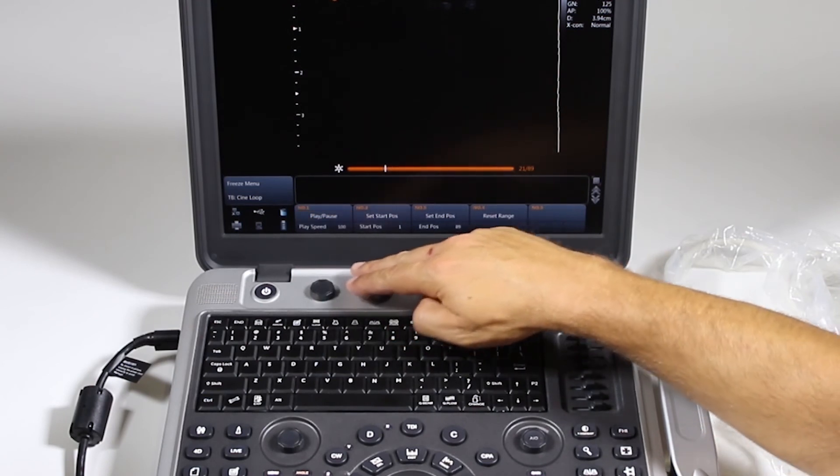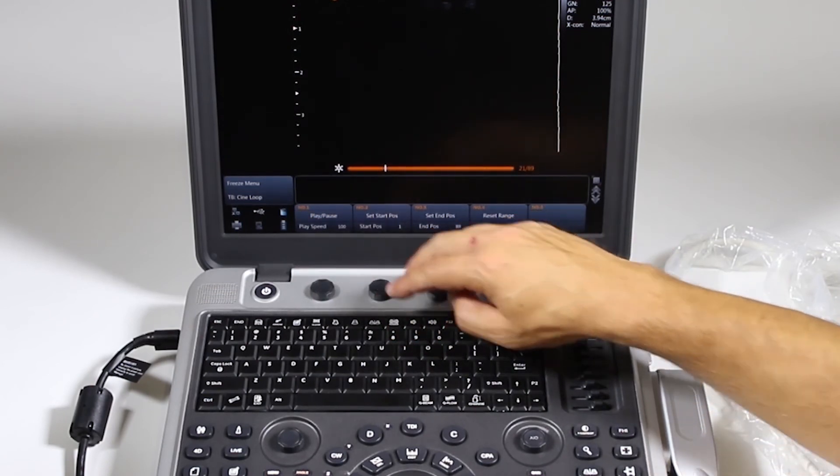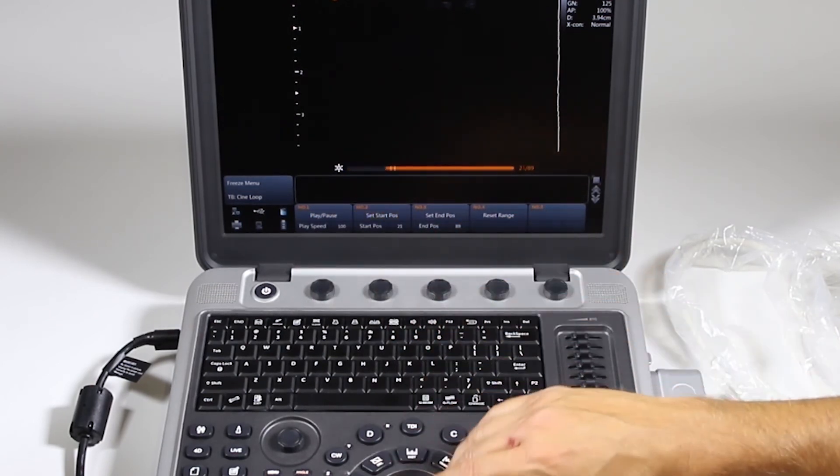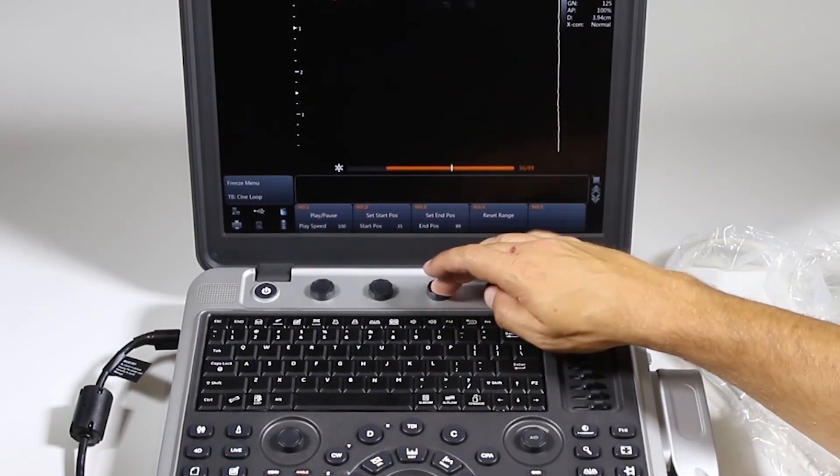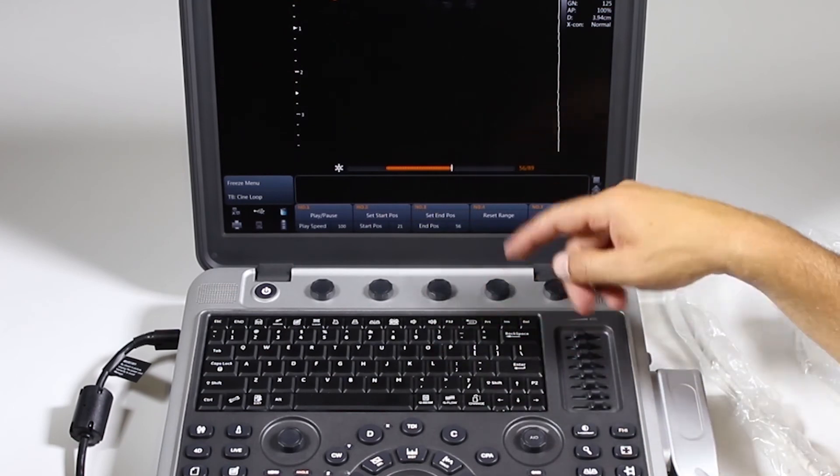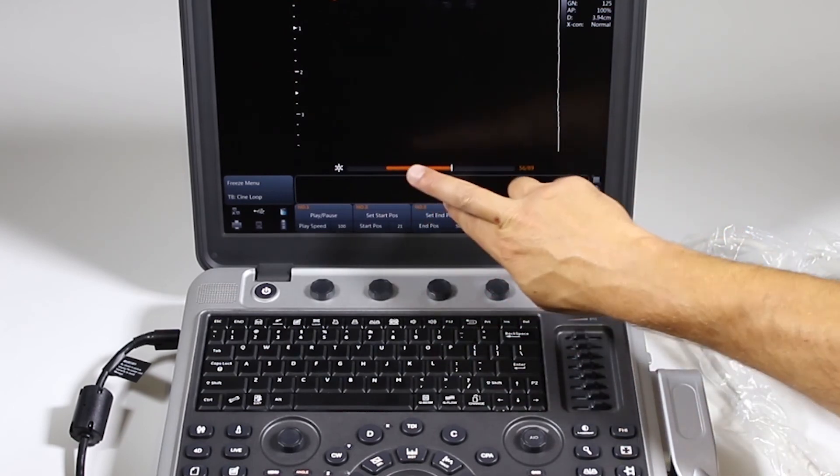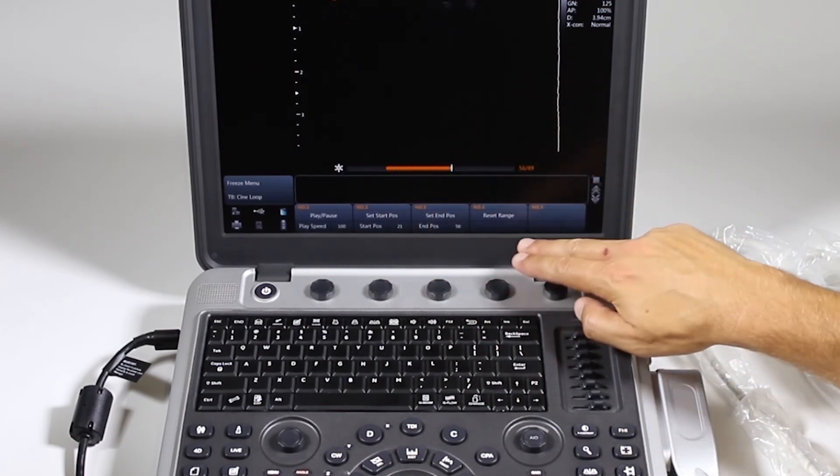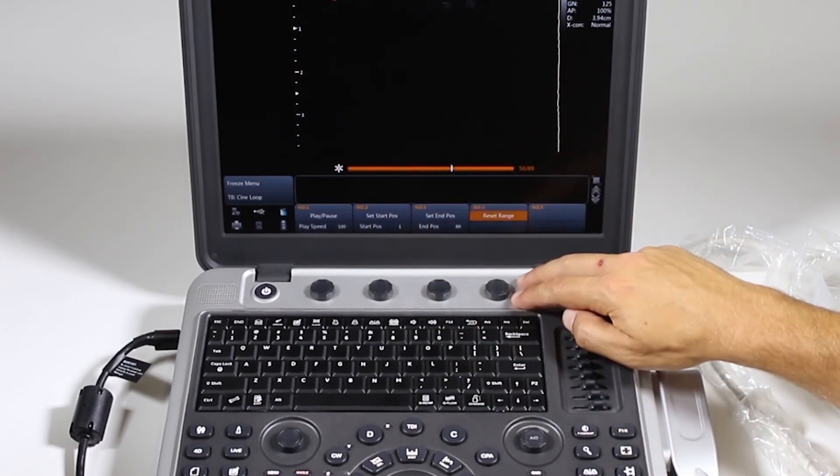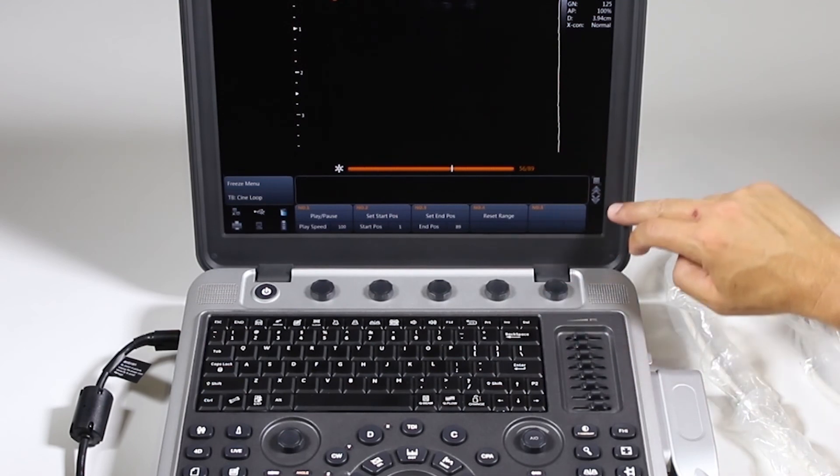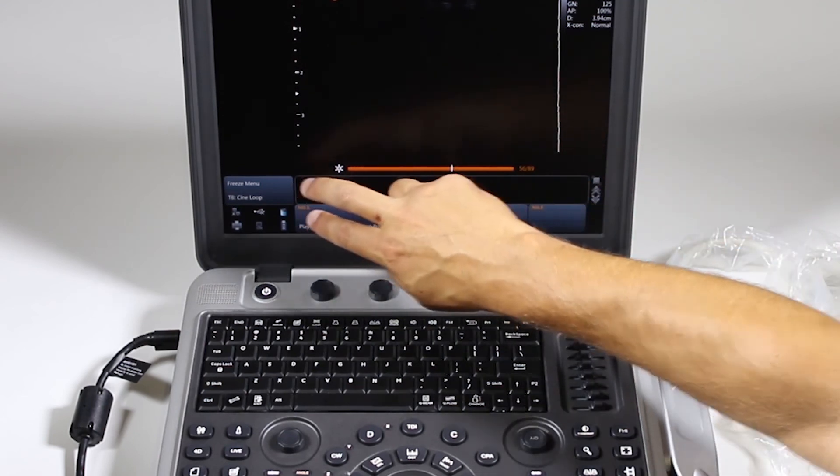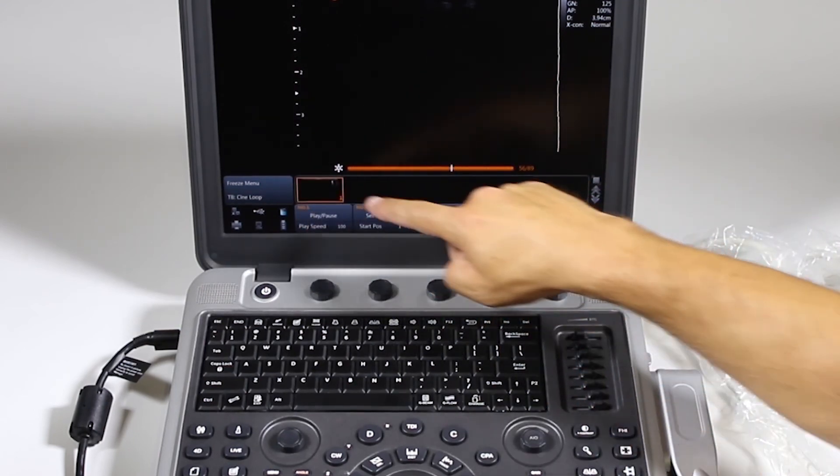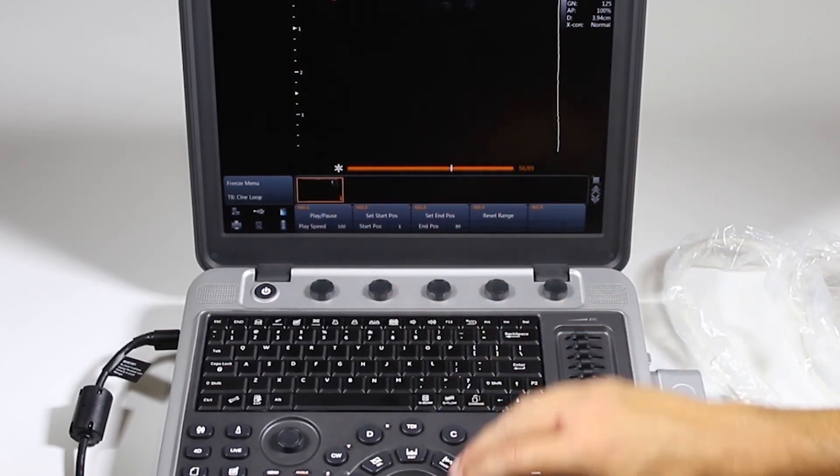Set a start position, and set an end position, and then save that portion of the Cine loop. Reset range. Along the bottom here, this right here, if I save an image, will be my thumbnail. And I can, as I showed before, I can click on that, and it will pull up up here.